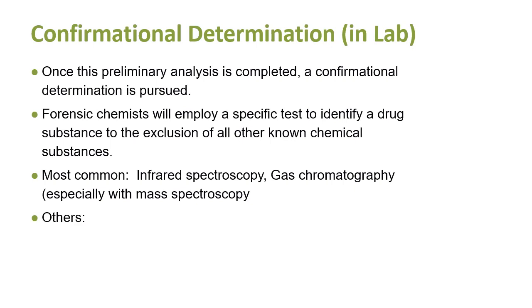So once we've done that preliminary screening, then we can move on to the confirmatory determination. This is a much more rigorous positive test where we're identifying the chemical. And once it's completed, we can say, yes, this is definitely cocaine. Yes, this is definitely LSD.